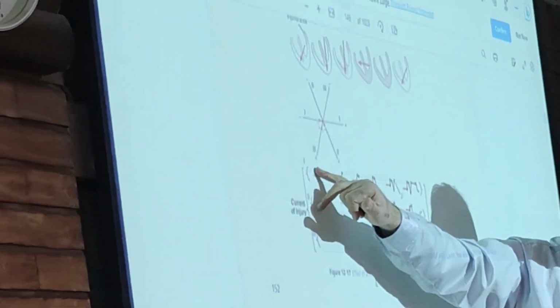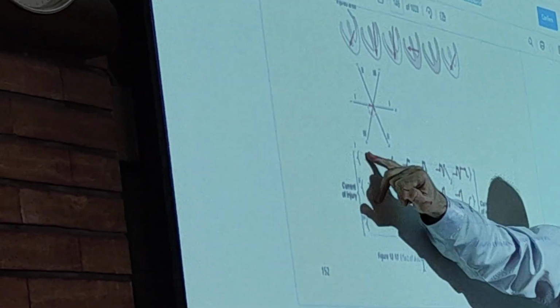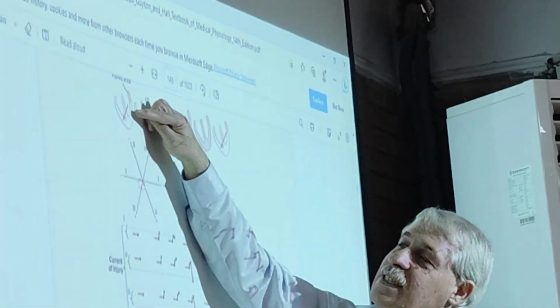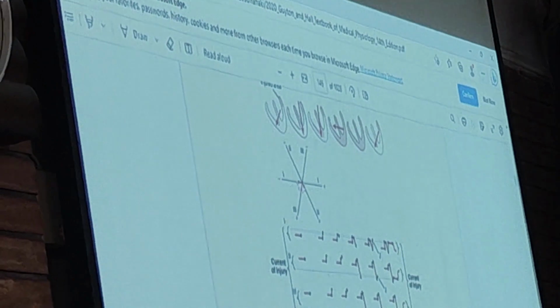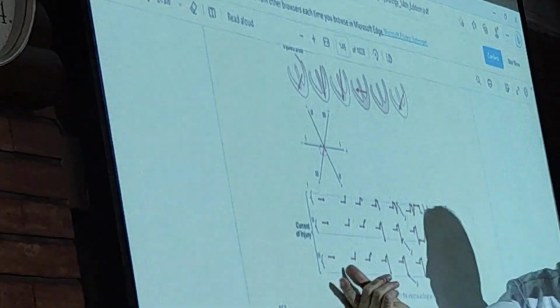See, this is the zero potential line. At rest, it is beneath the zero potential line. Here, take a look at limb lead 3. This is actually in the direction of limb lead 3. When the vector is in the direction of a limb lead, you have a positive deflection. Take a look at limb lead 3.